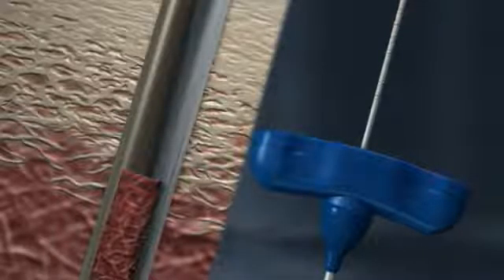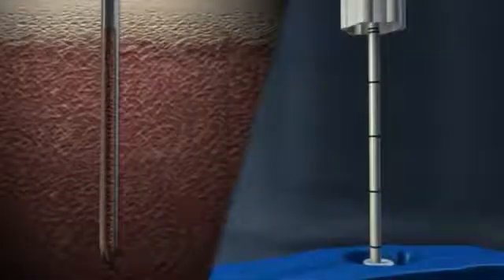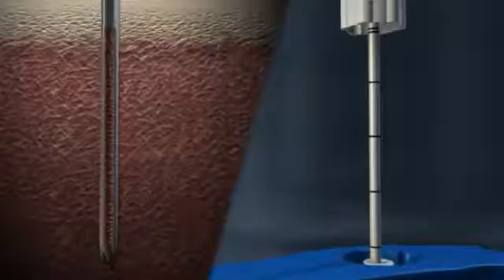With the needle in proper position, the marrow acquisition cradle is then inserted into the crown cannula, but only far enough for it to rest on top of the specimen. The resulting exposed length of the marrow acquisition cradle that is protruding from the proximal end of the crown cannula corresponds to the approximate length of the sample.